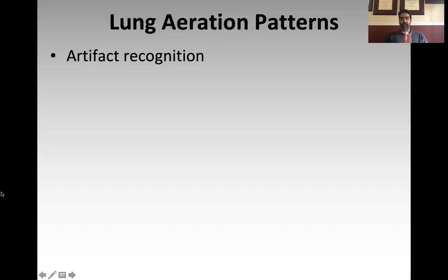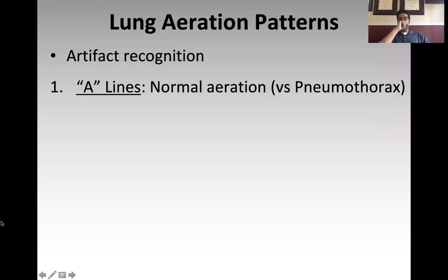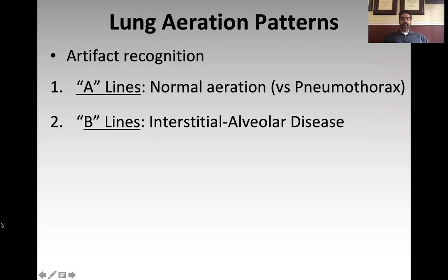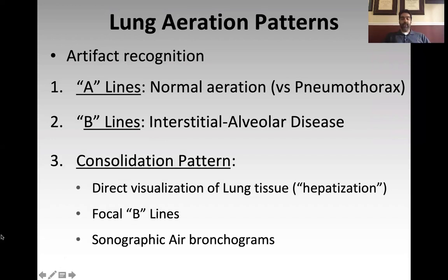Now let's talk about lung aeration patterns. The lung is an air-filled structure, so when you ultrasound it, you get artifacts. But there are very predictable patterns of artifact that give you valuable information about the underlying lung tissue. There are three artifactual patterns relevant to us: the A-line pattern, which means either normal aeration or pneumothorax; the B-line pattern, representing some sort of interstitial alveolar disease; and the consolidation pattern, where the lung is no longer aerated and you're directly visualizing lung soft tissue.